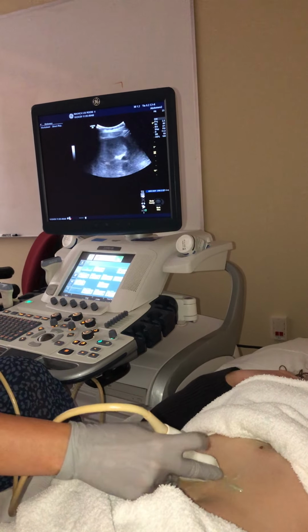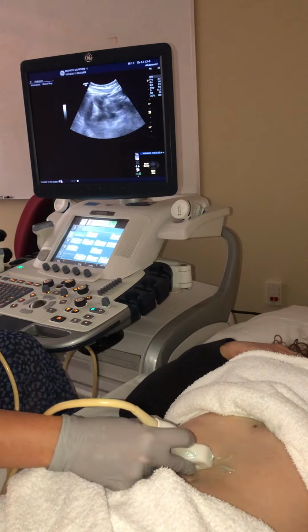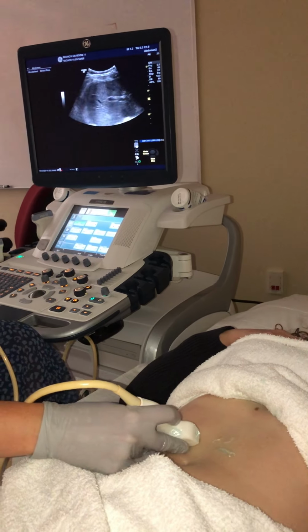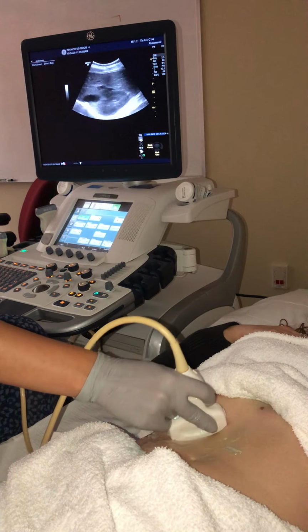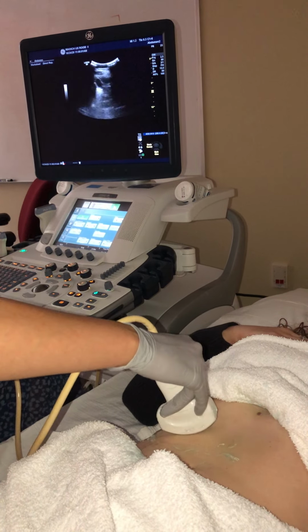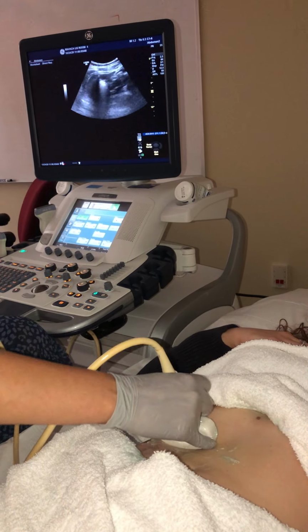So transverse right lobe, same thing. We're going to have her take a big breath in. We're going to sweep all the way up underneath that rib cage. Now, instead of my notch being pointed this way for our sagittal, we're going to be pointing down this way. So now our transducer is pointing towards us, towards the patient's right.